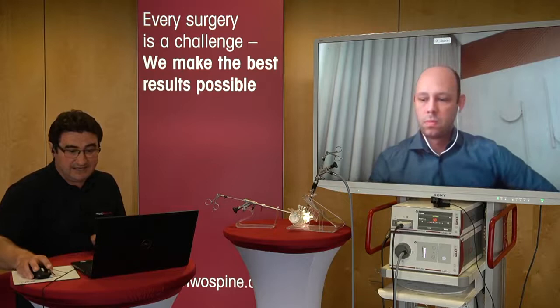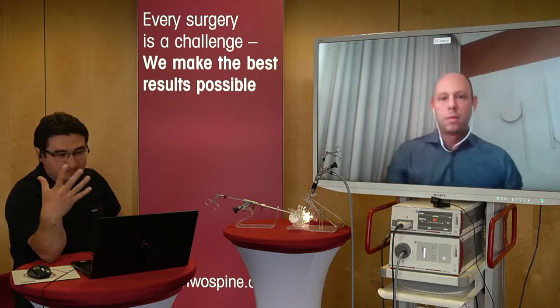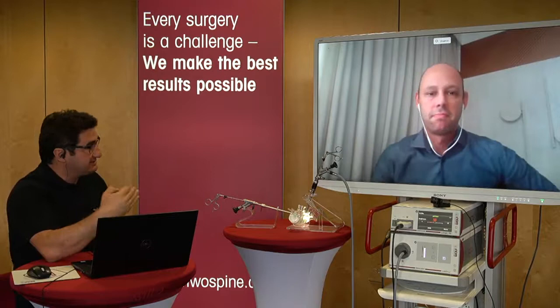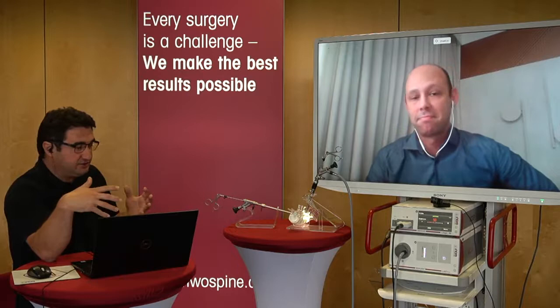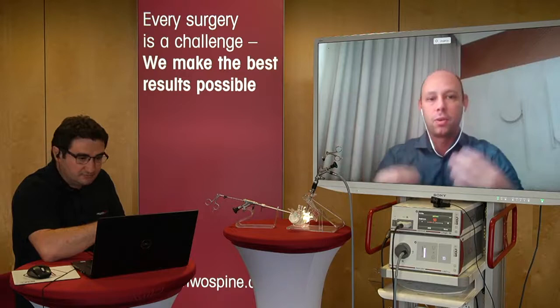Okay, another question. Is it possible to switch the scope from stenosis to interlaminar scope intraoperatively? If I start my procedure with the stenosis optic and I see some pathologies anterior to the dura or the root, then I need to resect it. Is it possible to change it? Yeah, of course, technically it's possible. You can change the work sleeve and the endoscope, but it's not necessary.